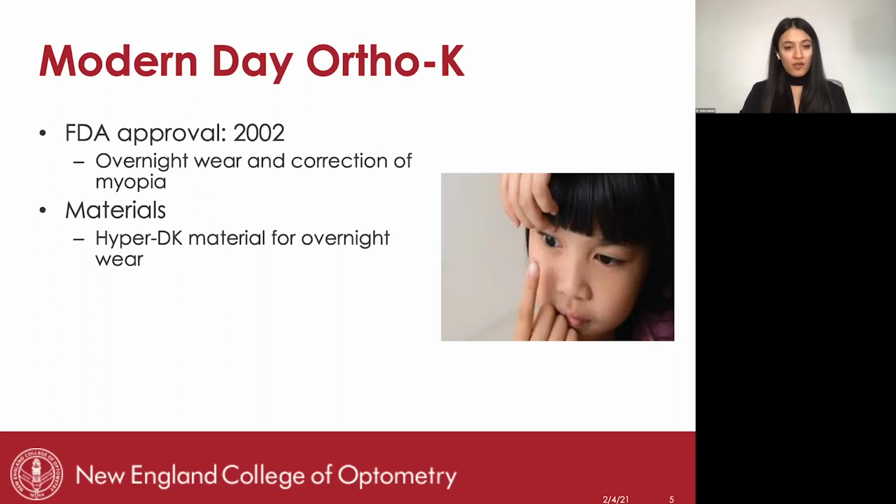They need to know that the treatment itself is FDA approved, but it's not FDA approved for the purposes that we're using it. So we do have an informed consent that indicates this, and we lay it out so that they know they're agreeing to an off-label treatment of myopia management and myopia control.